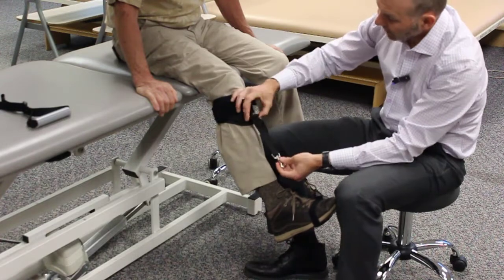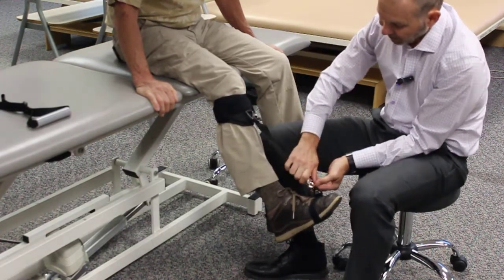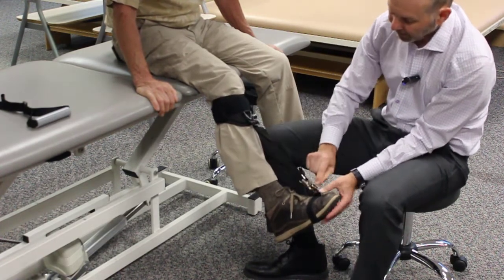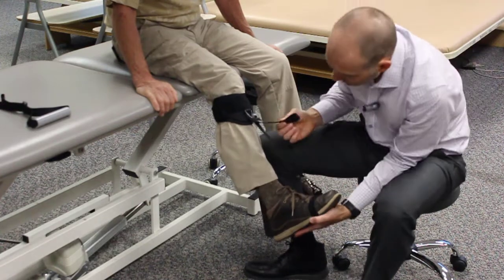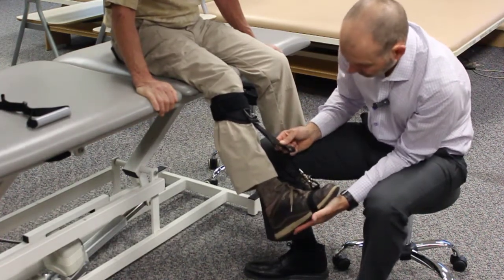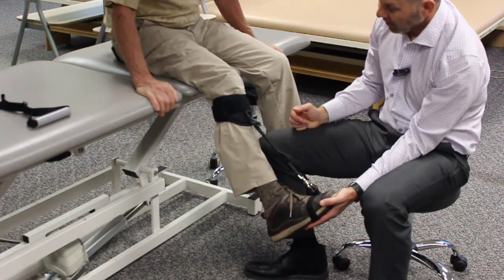Now we're going to adjust our length here. We're just going to lift up on that tab and pull some length out of this, and we're going to hook the little clip to our triangle ring here, and then we can adjust the amount of dorsiflexion by simply pulling on this as we lift up on the toe till we get the amount of dorsiflexion we want to achieve with the device.